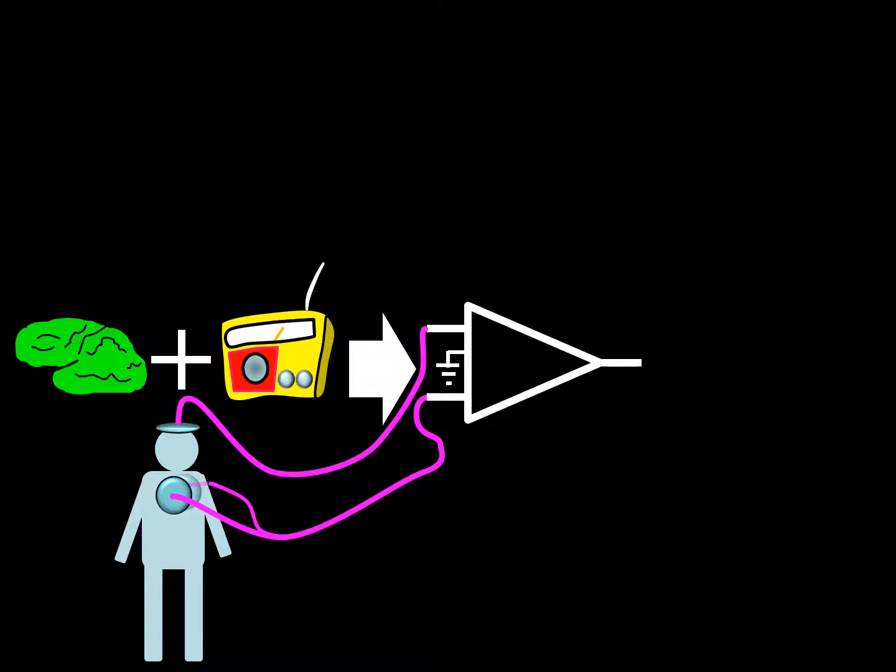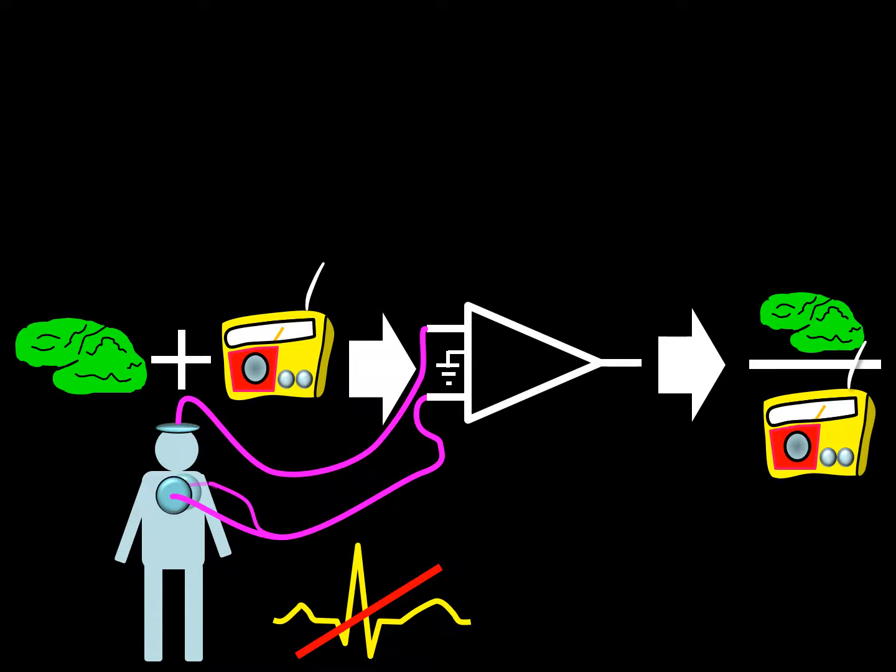Then they decided to improve on the use of an anterior chest wall electrode by using a second electrode in the posterior chest wall or posterior neck and connecting the anterior and the posterior electrodes together to input 2 of the differential amplifier. This way, EKG artifact was greatly diminished, and the cerebral activity was better visualized. But the search for a perfect place to put the reference electrode, that is the one that goes on input 2 of the amplifier, did not end there.